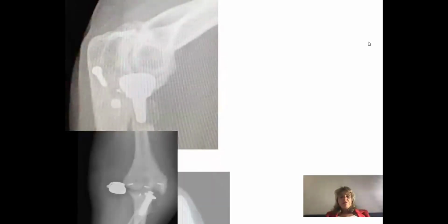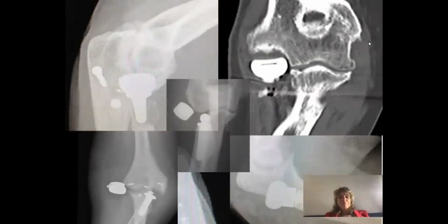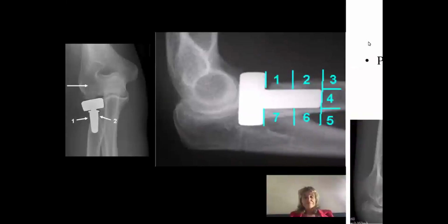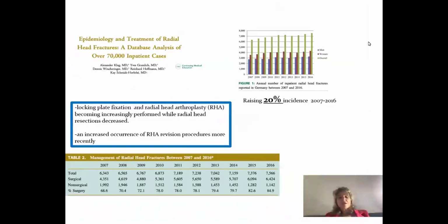So realize that every design of a radial head implant is related to certain complications. You can have malalignment, you can have erosion of the capitellum, dissociation of the radial head prosthesis. You can have dissociation of long-standing prosthesis after polyethylene wear, and you can have symptomatic polyethylene wear without dissociation. And of course you have loosening. And realize that if you have a subcapital loosening that is not symptomatic, that is physiological. So in most, especially uncemented stems, you see subcapital loosening, which will be stable within 2 years and doesn't give any symptoms and is not a reason for revision.